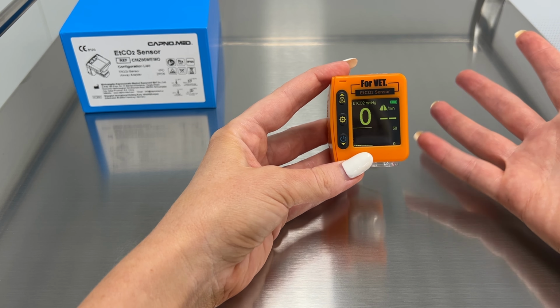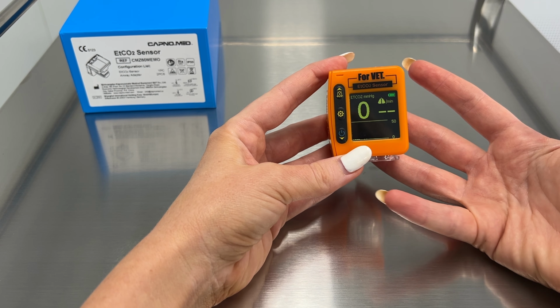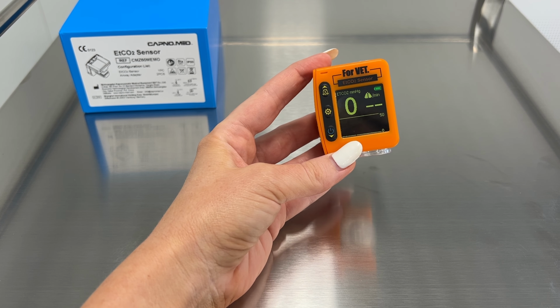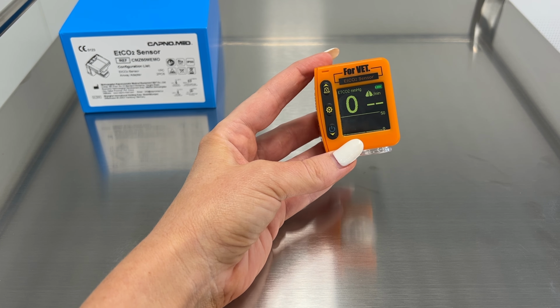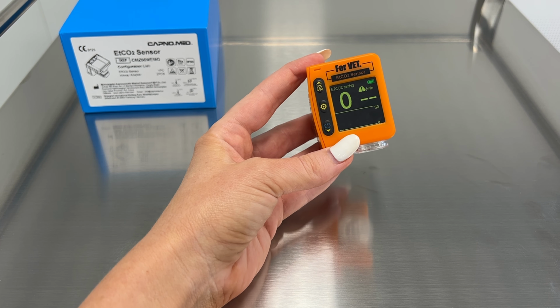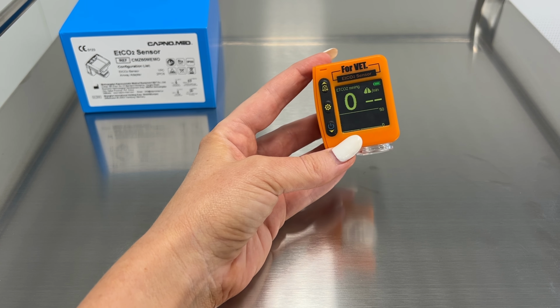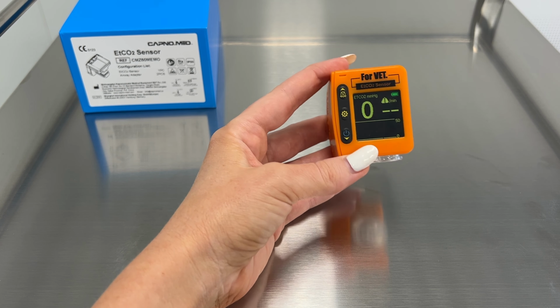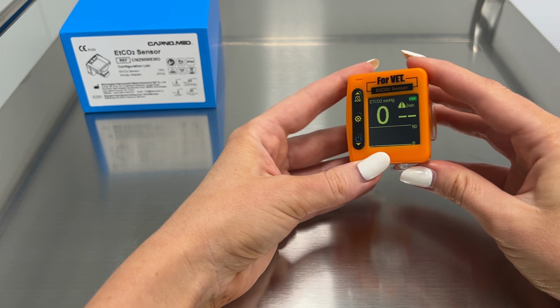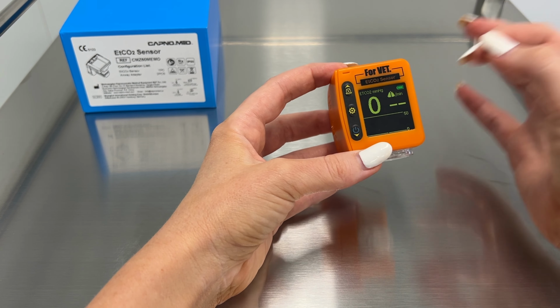I don't have it attached to any patients at the moment, so I'm not going to get a reading. But this little contraption measures your end-tidal CO2 and your respiratory rate. The normal parameters for your end-tidal CO2 in dogs is about 35 to 45, and for cats it is 28 to 32. Normal respiratory rate would be about 10 to 30 for dogs, and cats would be about 20 to 30. So that is the normal parameters that we want to monitor.